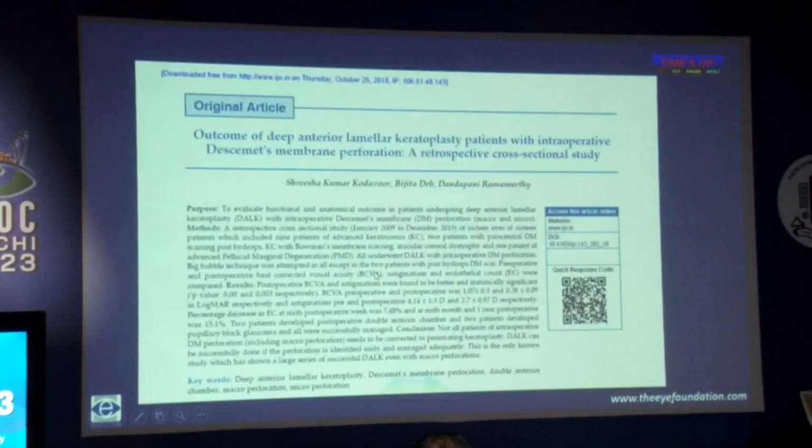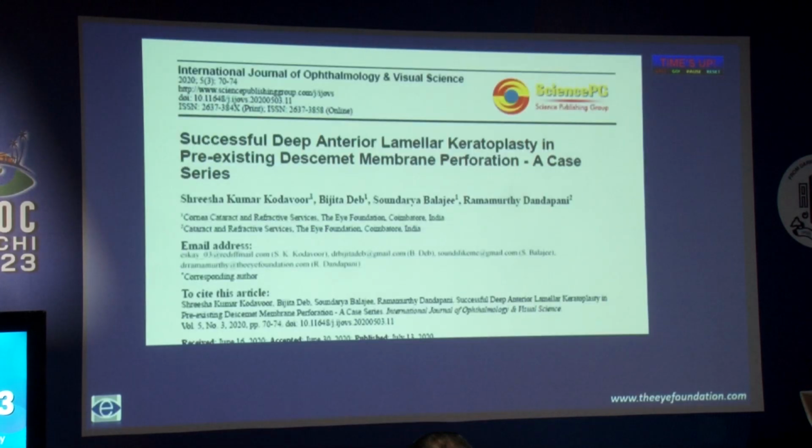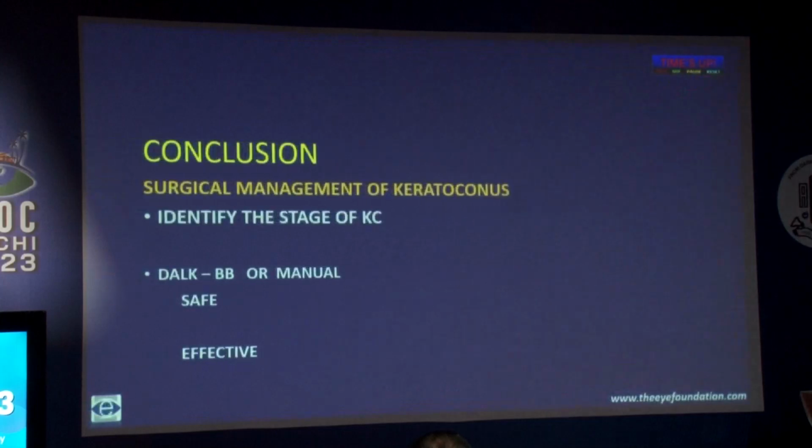So DALK can be performed in these cases. In spite of having perforations, you can continue with the DALK. Manual DALK is a savior. You can always learn to do this particular procedure.